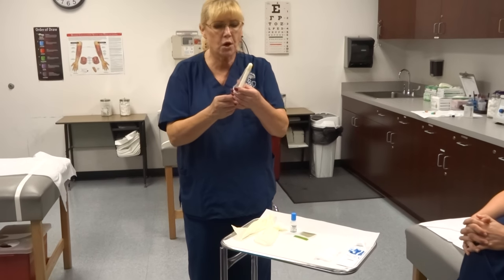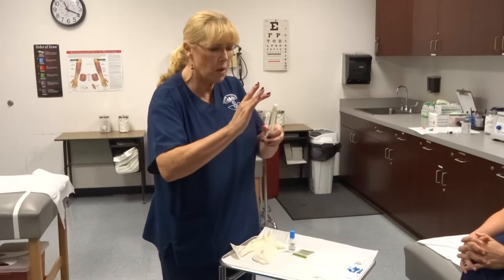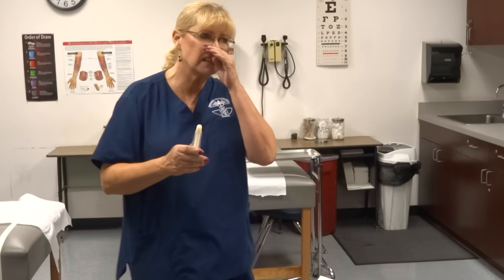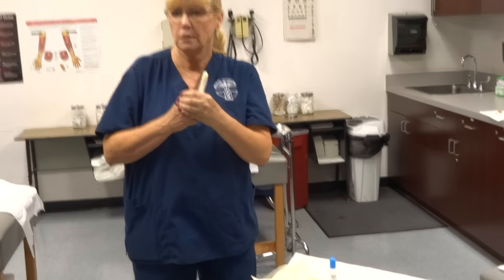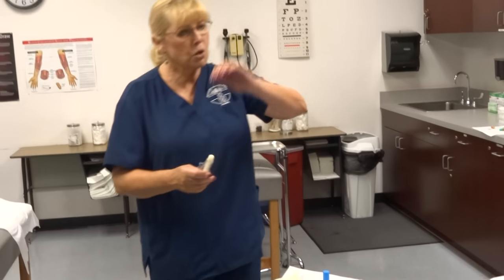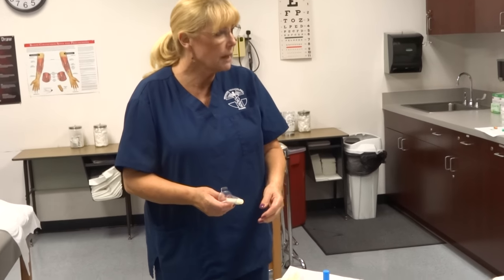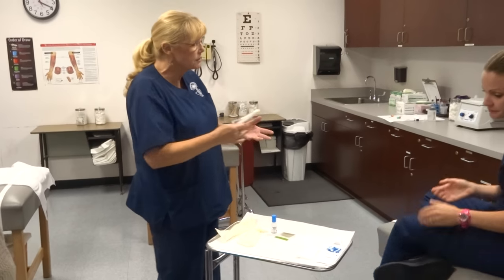This is a proctoscope. So what the doctor's going to do — he's going to put his glove on, take a little KY jelly and put it on the tip. What position is the patient going to be in for a rectal exam? Left side. It's actually knee chest, just on their side — like fetal position, but on the left side. Left gives us better access to the rectum and the sigmoid colon.